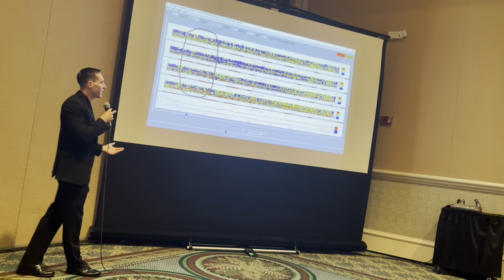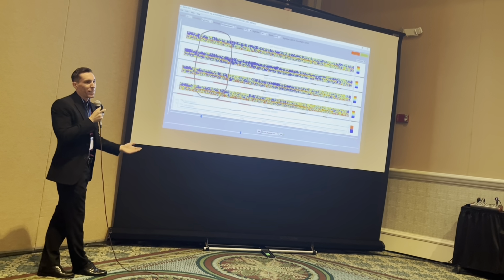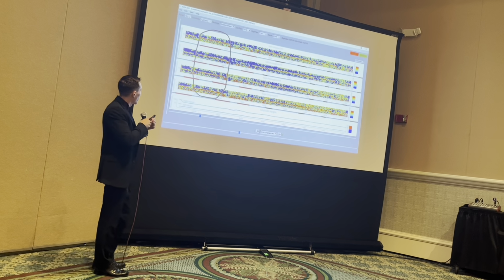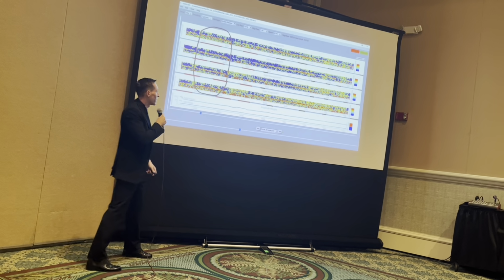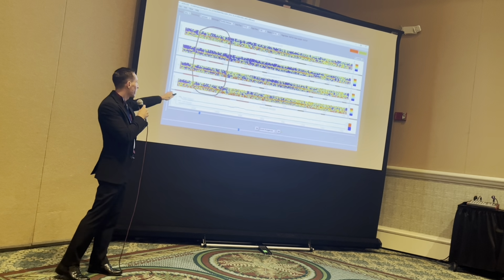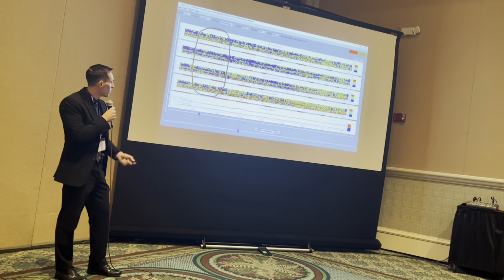When you're looking at an EEG and you want to count the background, you want to look at the best spot. You're not going to look where there's a bunch of artifacts. So this part where I circled is where the patient's eyes are closed and the patient is relaxed. That's why you can see a clear, nice red stripe at 10 waves per second.